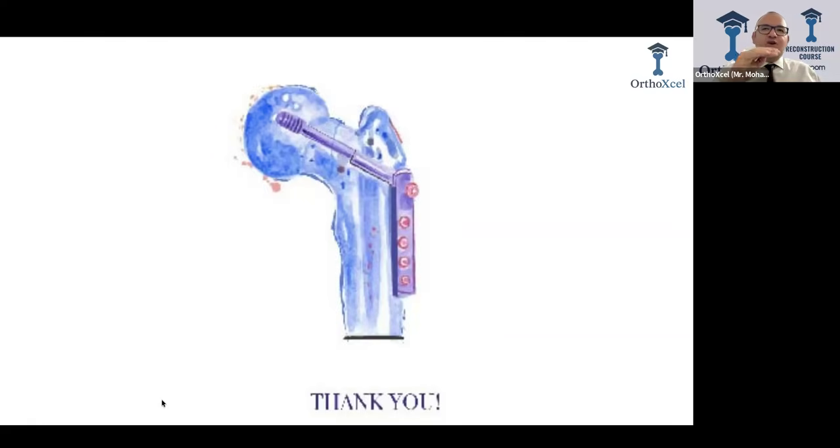So theoretically, you're moving the stem up and down, you're changing the length in the templates. But actually, in real life, every time you move it up, you shorten the offset, you move it down, you lengthen the offset. So it's a triangular relation. You cannot change one limb of the triangle without changing the other 2 limbs. So realistically, every time you're changing the leg length, you will change the offset.